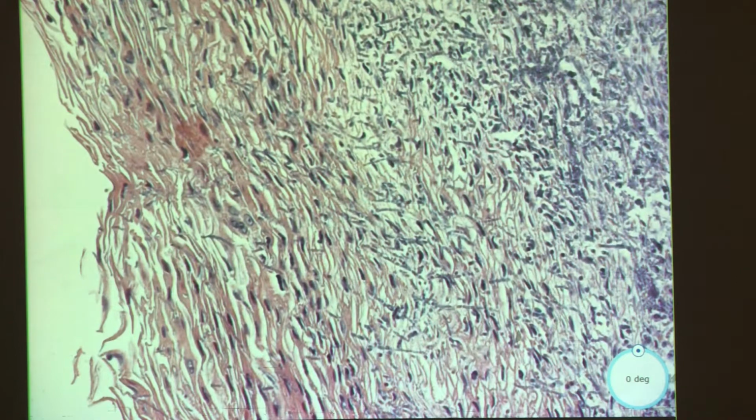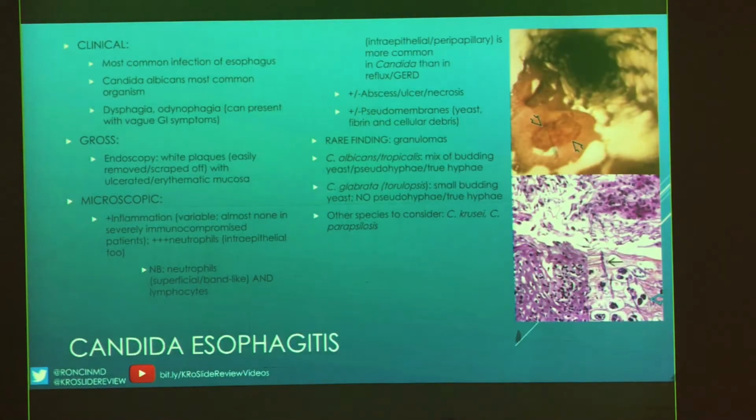And then yeah, the squamous epithelium is extremely reactive. It's not happy with this. There is some ulceration, like maybe a little granulation tissue in some spots. So that's what this is.